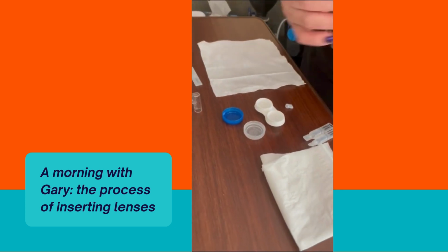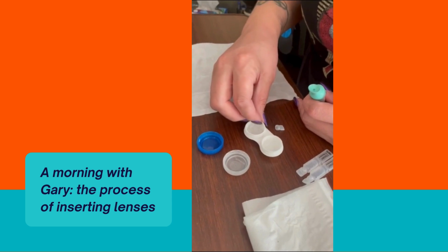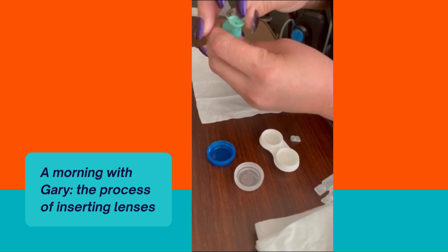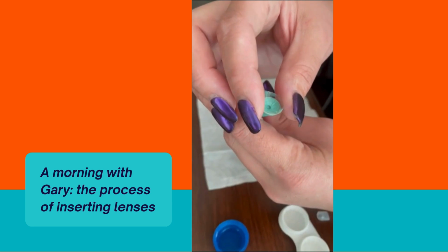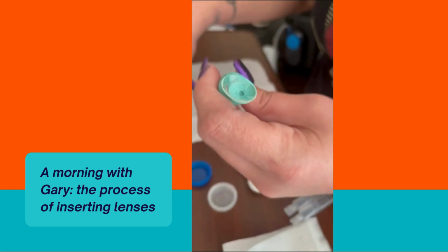But you don't. Okay, so we're going to put the right one back in now because we took it out. We're just going to slip it on through, give it a look to make sure it's okay. This is the right contact, and we're twisting so our dot is at 12 o'clock. We're going to do 4 drops.